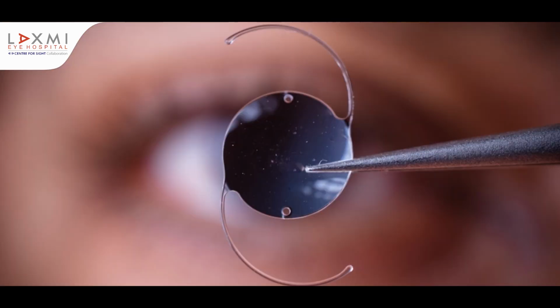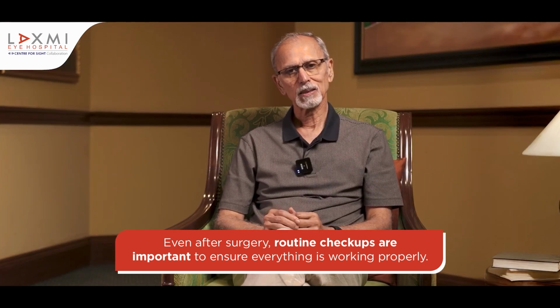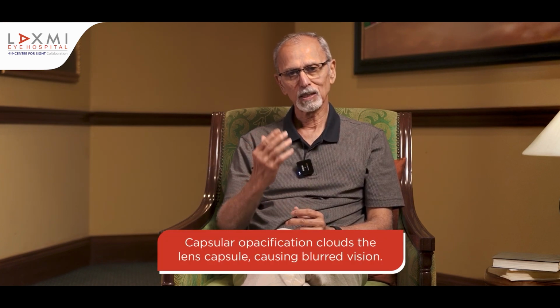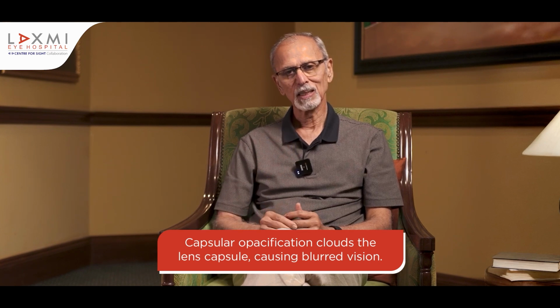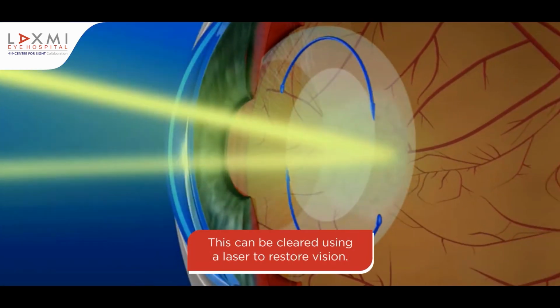Now, all these lenses, once they are implanted, normally stay in the eye without any issues, but they still need to be checked maybe after 6 months or on a yearly visit. The reason being, after the cataract surgery, there's a condition that happens called after cataract, or capsular opacification. Once the capsule in which the lens is put develops some opacities, the vision starts dropping. And if you notice that and the vision has dropped significantly, then with laser those spots can be cleared.